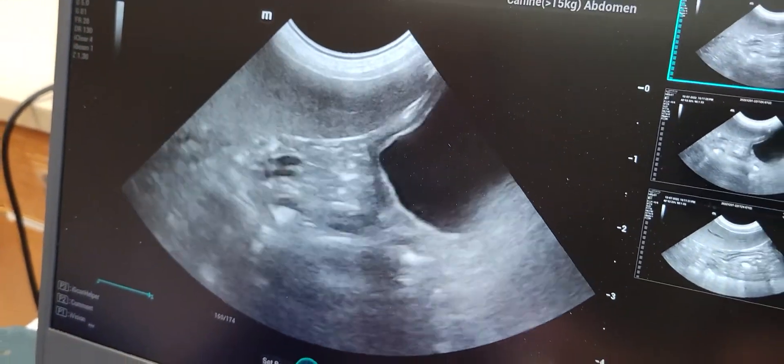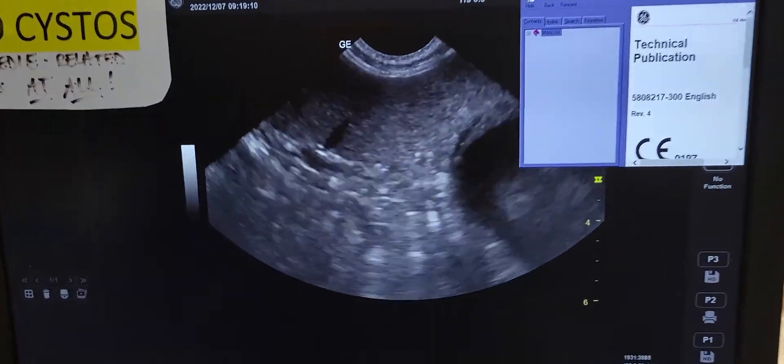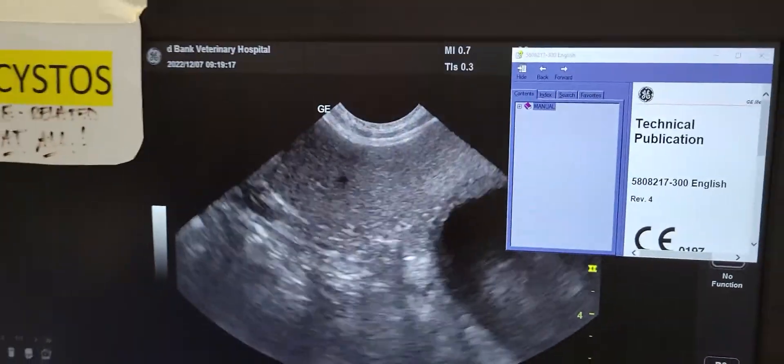Right there, this is the Versana balance. That, we can do a little better in the near field. Let's make this more fair. There, there.